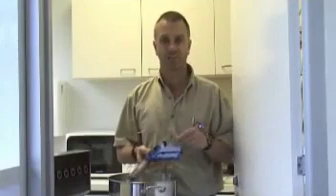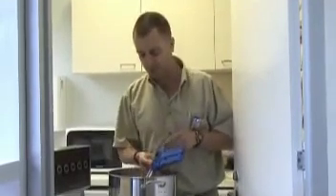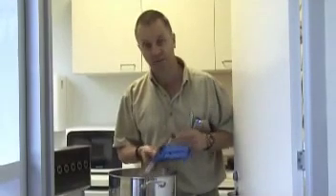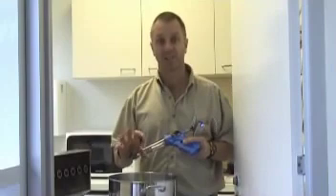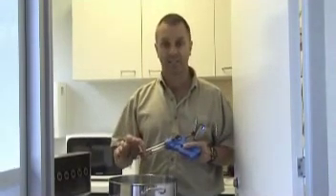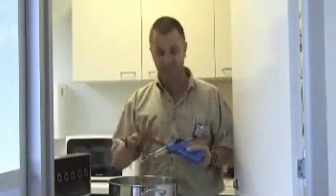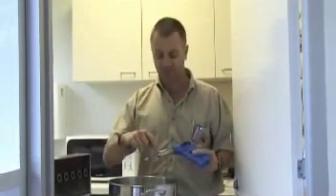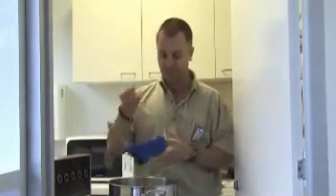The other important thing to remember with all the NJ Phillips applicators is to put water into the barrel. So put water into the barrel before you sterilise it. It's important you do that. If you don't put the water in the barrel, the cylinder can be affected by the steam being caused by the bubbling. So in this instrument I've got water between the O-ring and the front there, and that's all I need to do.